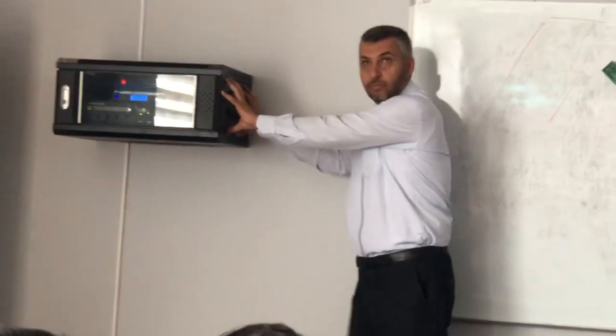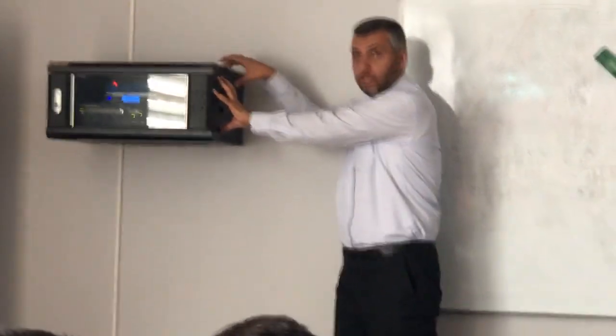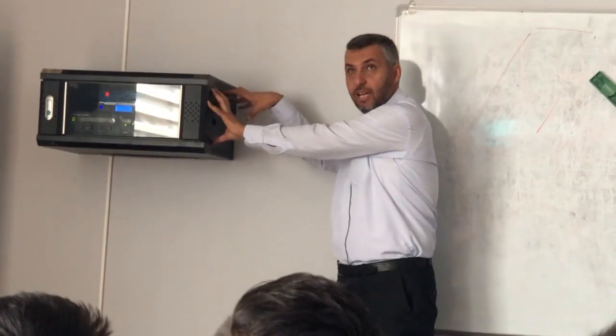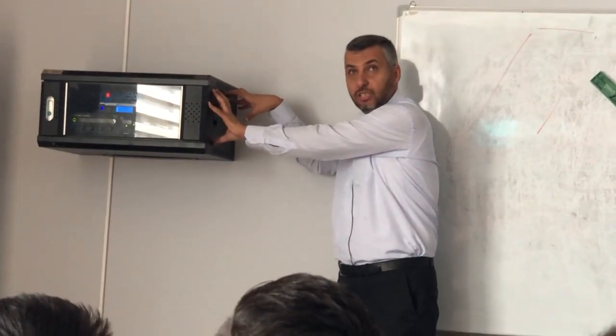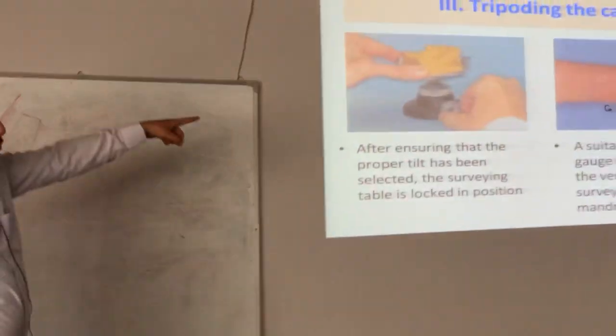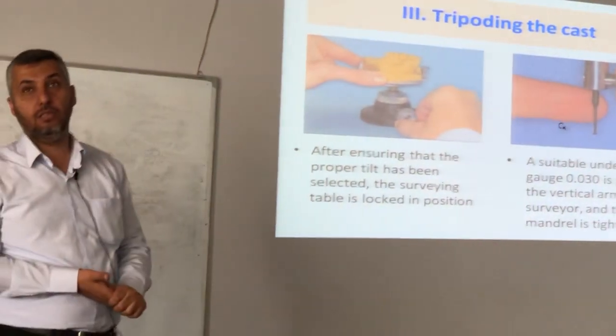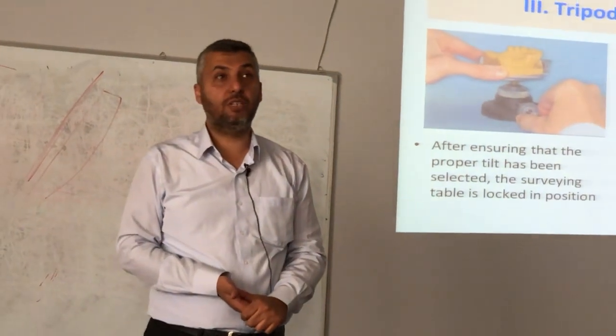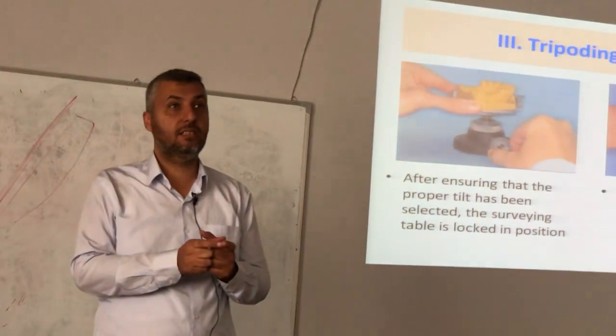I have now 10 fingers on this board. If this one changes, maybe only 4, 5 or 8 fingers touch this object. But I will change this object until all of the marker, the 3 points, contact the marked area. This is called tripoding. It's a reference, a dalil.